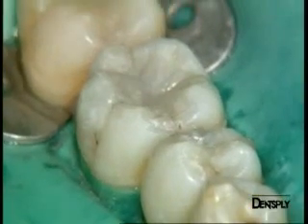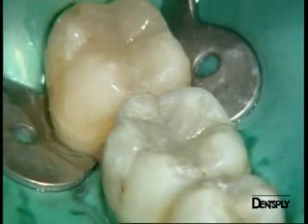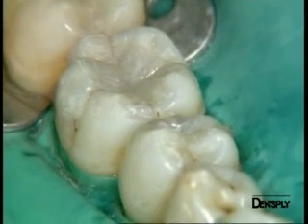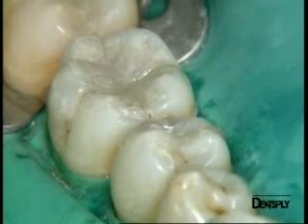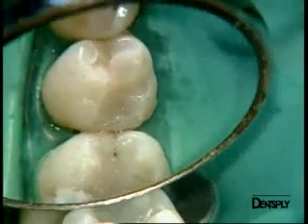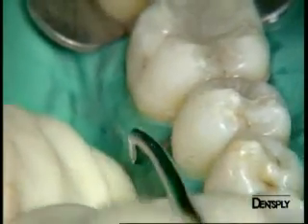You can see on this occlusal view the difference in shade due to the translucency of the material. This permits a deep photopolymerization. However, when replacing amalgam, discoloration caused by the amalgam is shining through to the surface. The cosmetic result is infinitely better than anything achieved previously. We do have some excess adhesive on the premolar, which can be easily removed with a periodontal scaler.